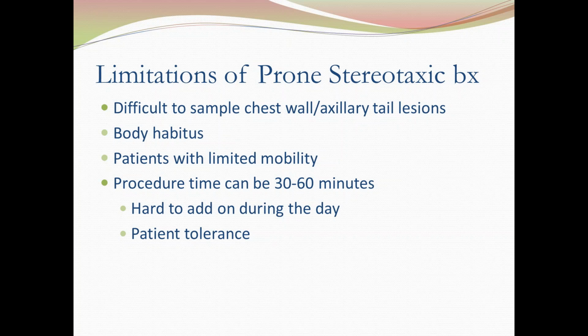When we do a stereotactic biopsy at our institution, we block out 60 minutes to do that biopsy. If you identify something on a diagnostic mammogram during the day, it's almost impossible to add it on. You have to schedule the patient for a future time. And some patients just can't tolerate it. They just can't lie on that table, and that's a problem.